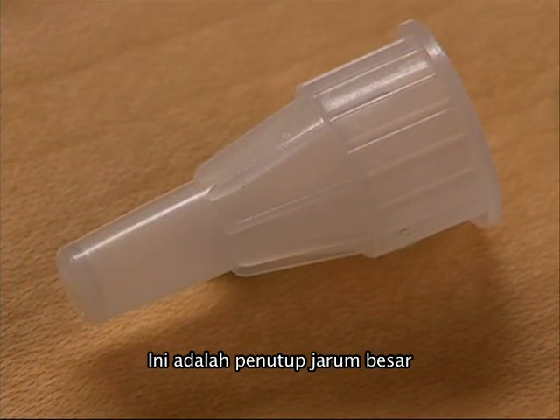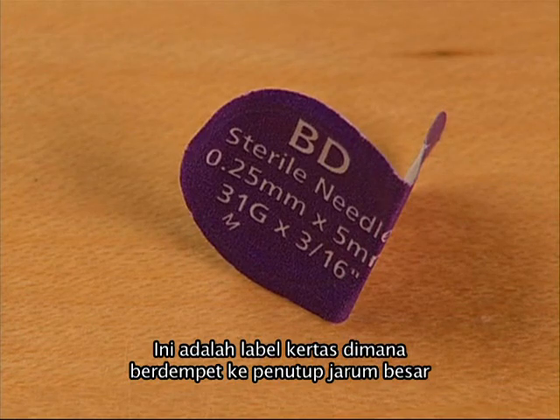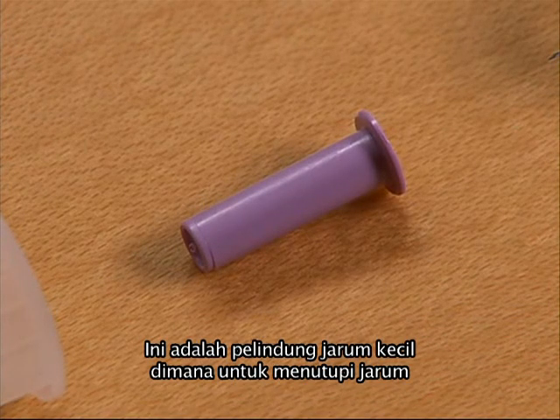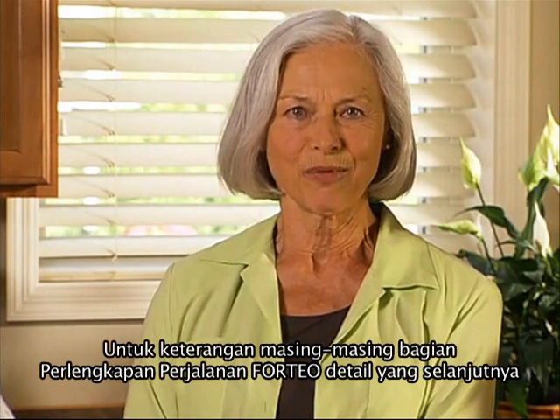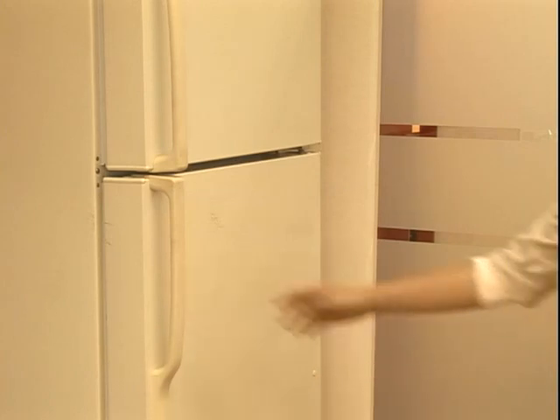This is the large needle cover. This is the paper tab that is attached to the large needle cover. This is the small needle protector that covers the needle. This is the needle. For a more detailed explanation of the individual parts of the Forteo delivery device, be sure to refer to the user manual.